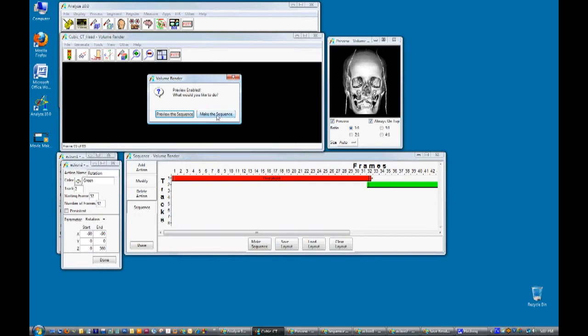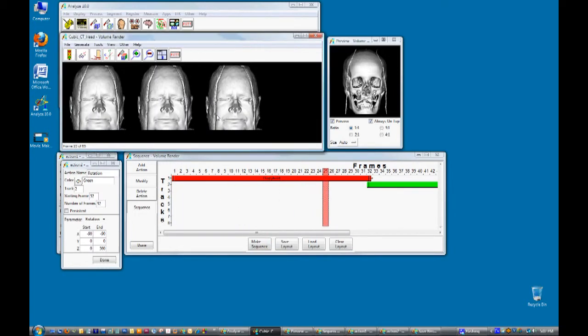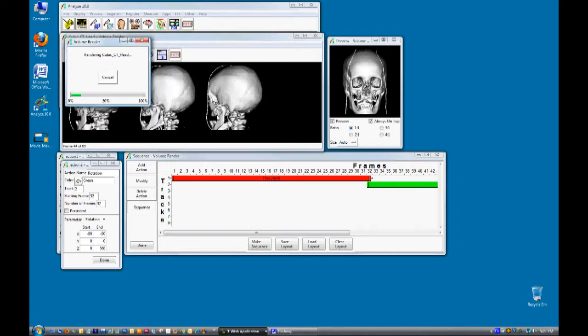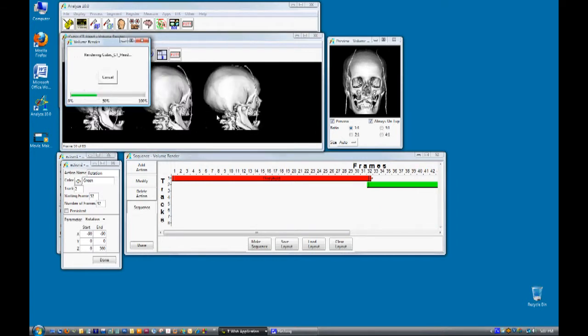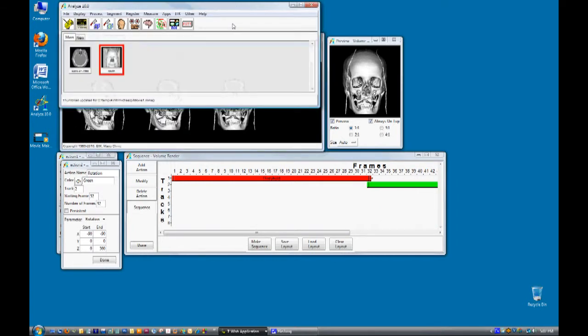Click on make the sequence. The sequence will be made and automatically saved to the analyze workspace. Here the movie can be previewed in the movie tool.